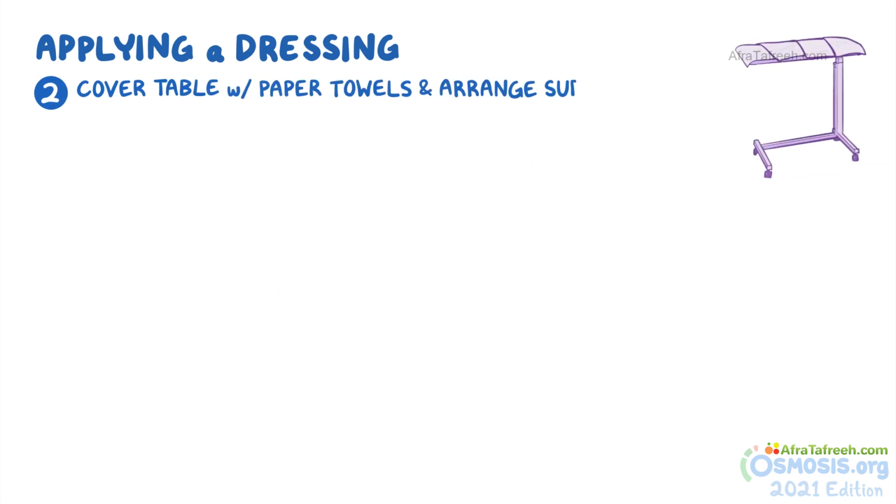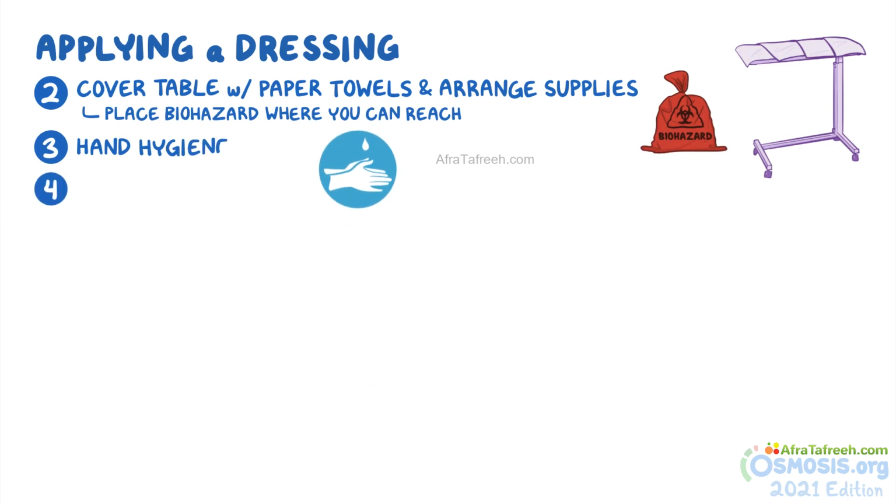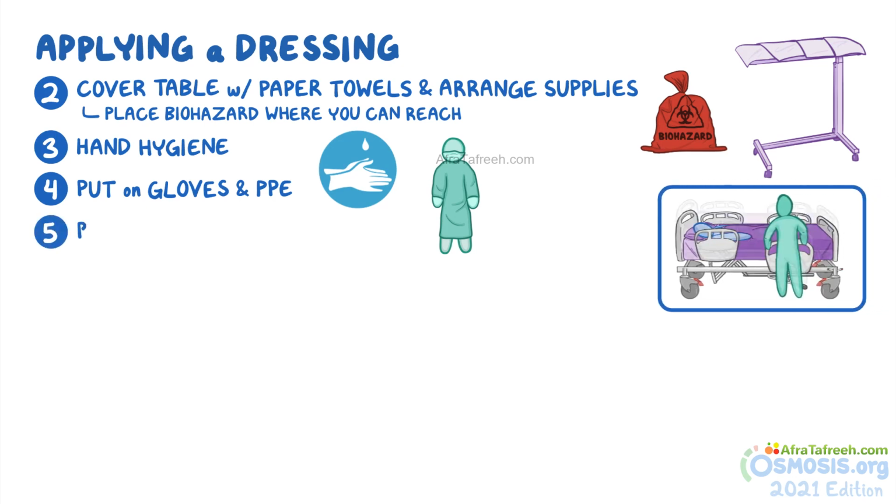Cover the bedside table with paper towels and arrange your supplies. Place the biohazard bag where you can easily reach it. After performing hand hygiene, put on clean gloves and other PPE as needed. Then raise the bed to a height that's comfortable to work with.